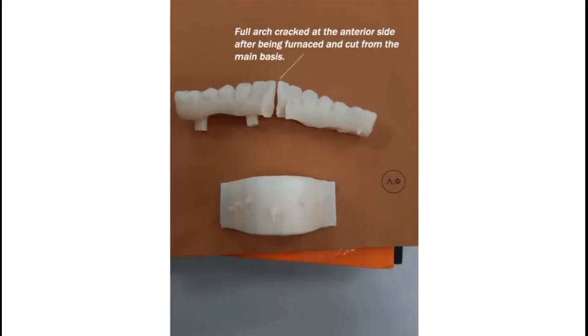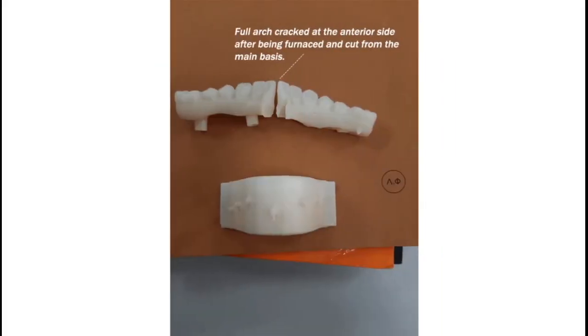Tip 1: Cracking can be reduced by relieving inside pressure. This can be achieved when the supporting basis is CAD-designed to be hollowed out for the full-arch zirconia.